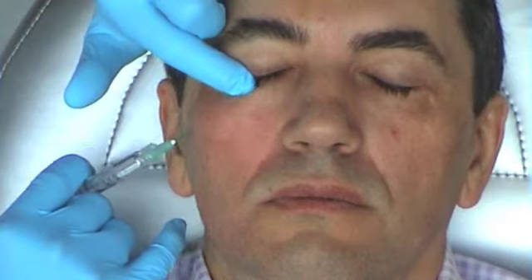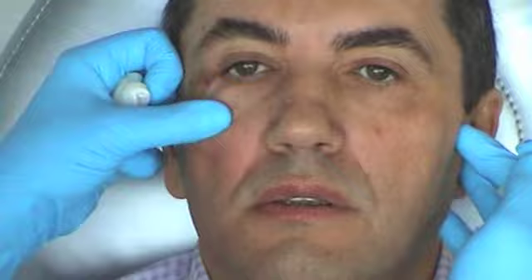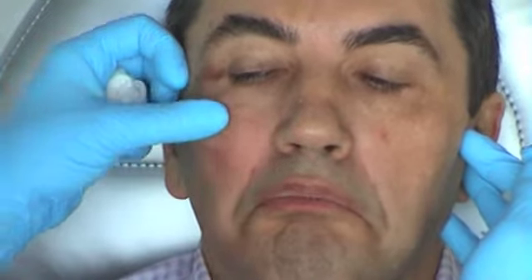Orbital rim. This is the zone you don't have to overpass. So this is the first step. The second step — I did this like a fan, okay? And then I will do this. So I never show the needle to the patient. This is because of the live injection.